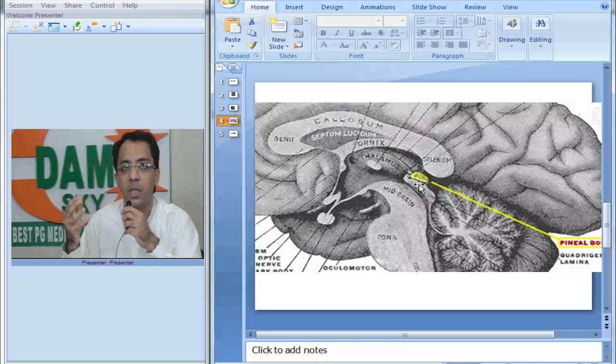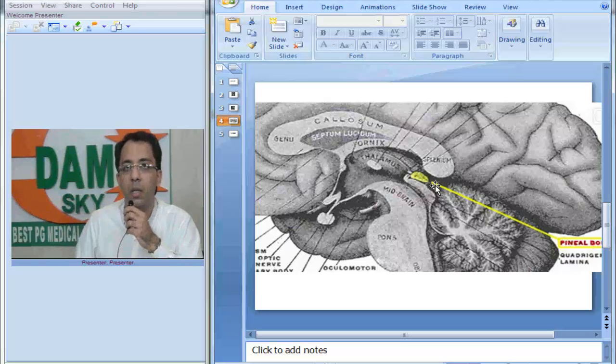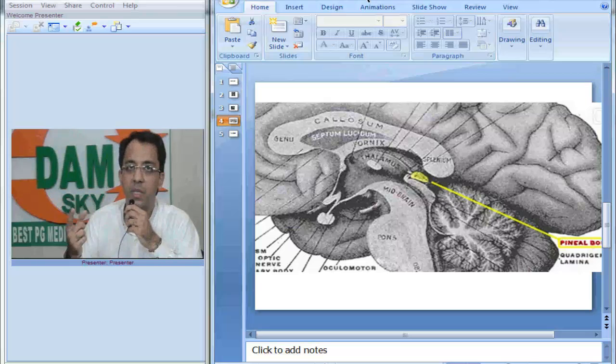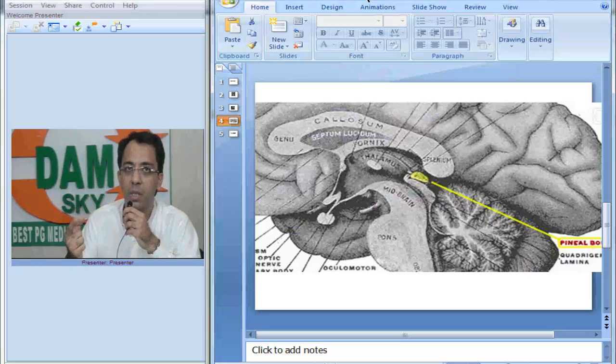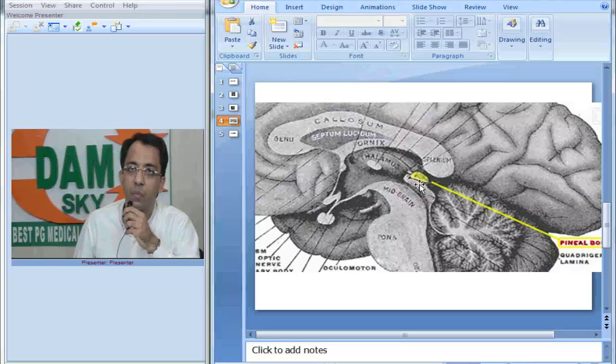This is also called as the tectal plate and this is the pineal gland. Now think of a pineal tumor like we were discussing just now, a germ cell tumor of the pineal—which anatomical structure will it compress if it grows.